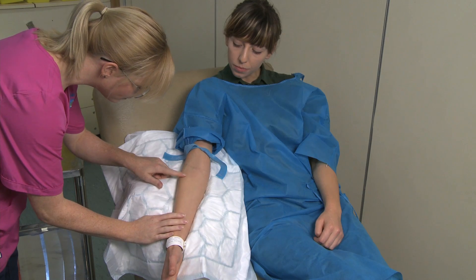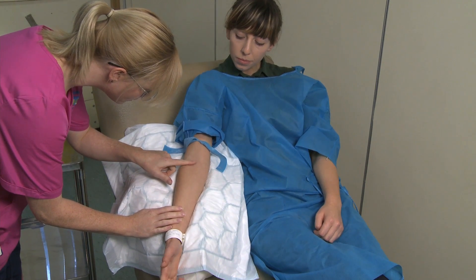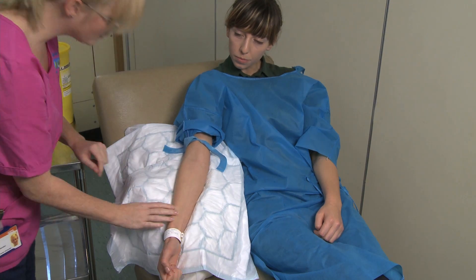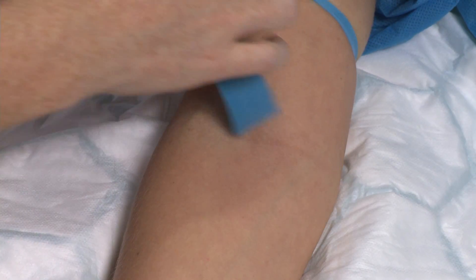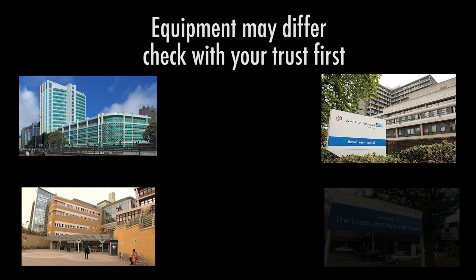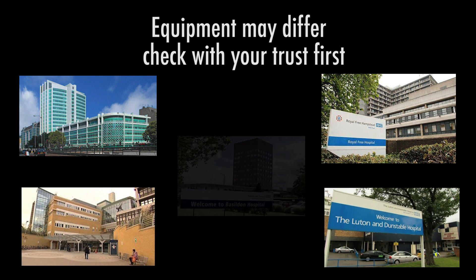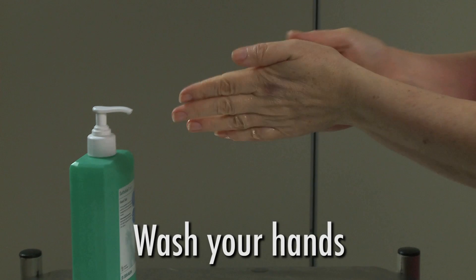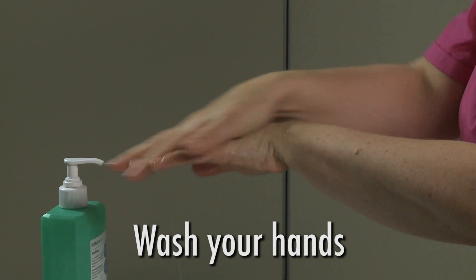If you find the veins are difficult to see and feel, then it may be appropriate to ask someone more experienced instead. Release the tourniquet before leaving the patient. Now gather and prepare your equipment. Please note that you will be spending time in several different hospitals throughout your training. Each hospital will have its own cannulation policy and some of the equipment may vary slightly. Wash your hands again.